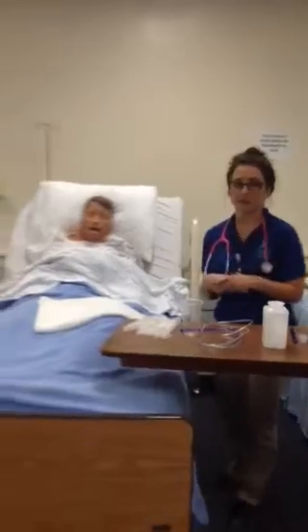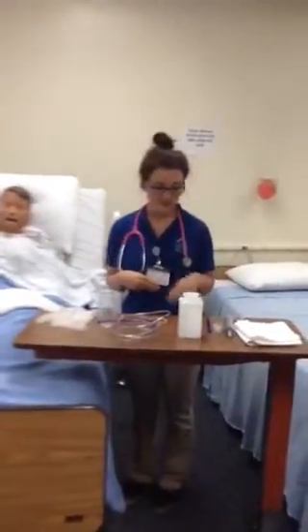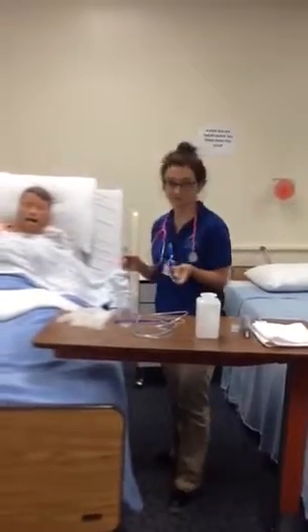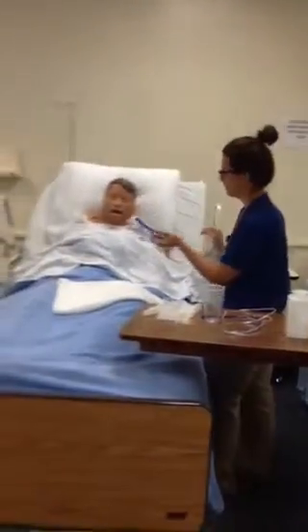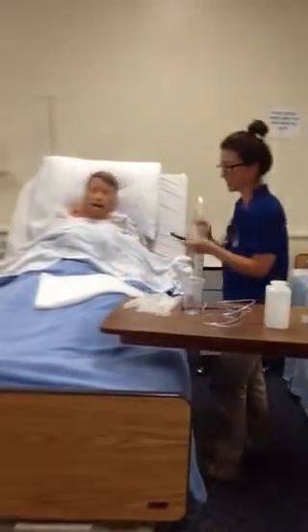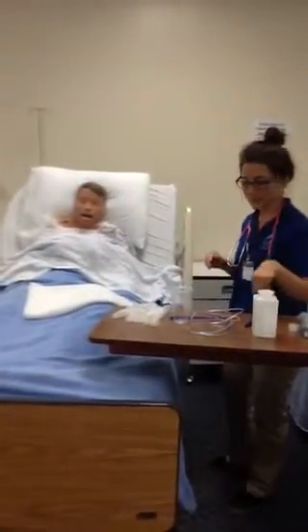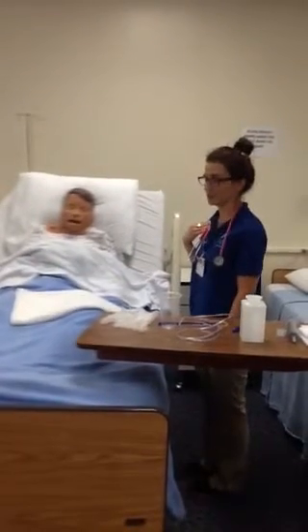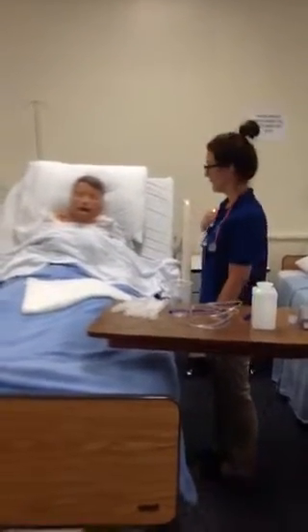All right. So before beginning, I'm going to assess the patient's oral cavity and the patient's nares to make sure they are open. Okay, they are clear. Mr. Wilson, I'm going to have you hold one of your nostrils and breathe through it. Can you go ahead and do that? Okay, your other nostril?